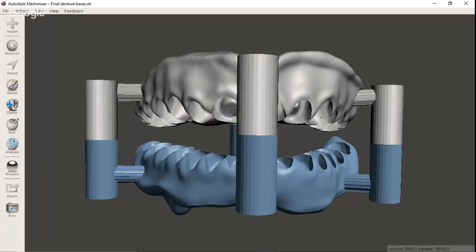So, in the old school prosth, if you were to do a remount when you're delivering dentures, you would capture a bite, and then you would go back into the lab and you would pour up something to articulate these upper and lower dentures using that bite, and then you would grind in your occlusion and make it nice and perfect and get excursions.